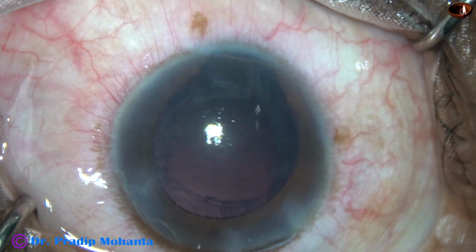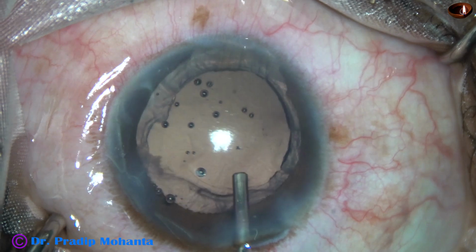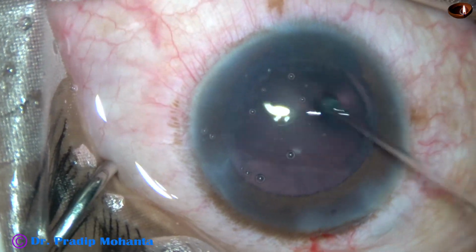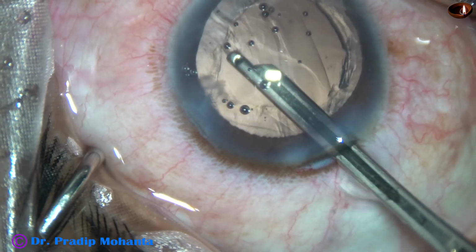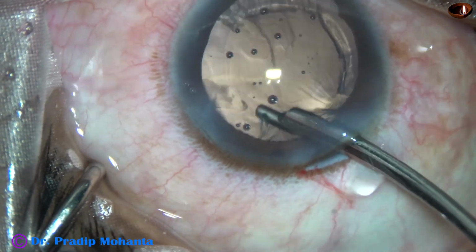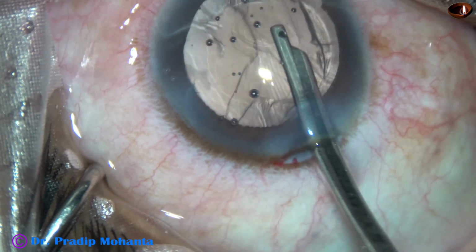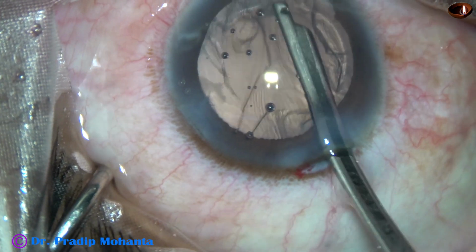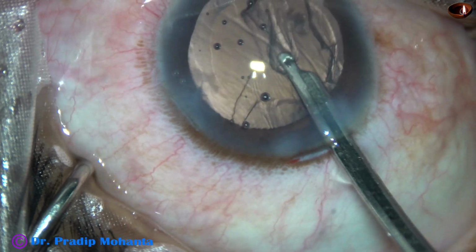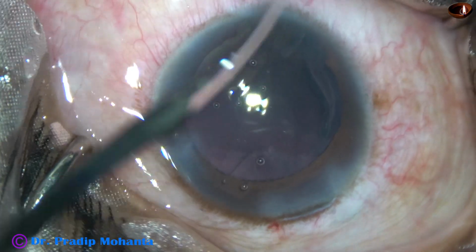I come out, inject visco to fill up the anterior chamber and the capsular bag, and now I'm going to remove the cortex. I want to remove the 6 o'clock cortex later because there is zonular dehiscence. I want to clean the cortex from other parts first. So cortex from 5 o'clock is being removed at this time. And now I come out at this time.